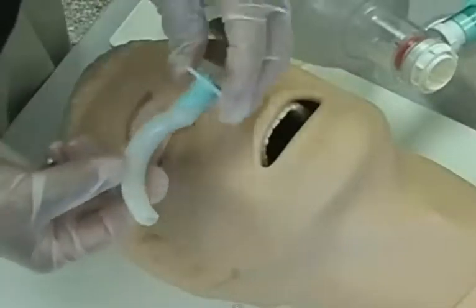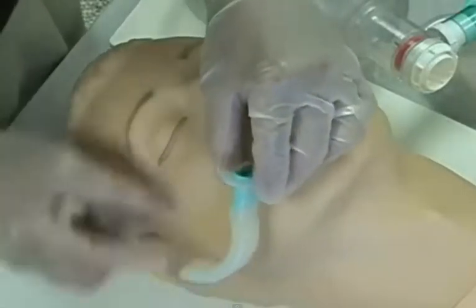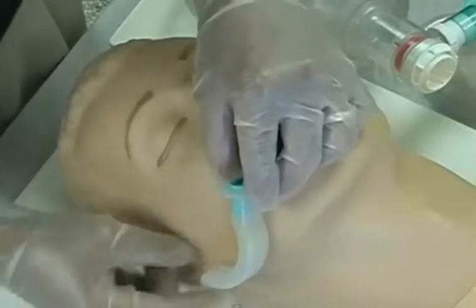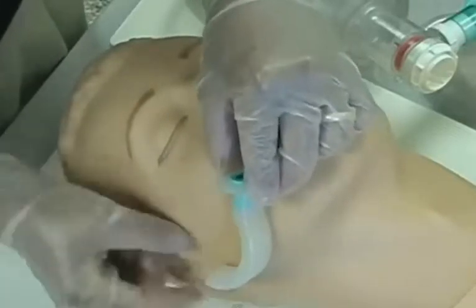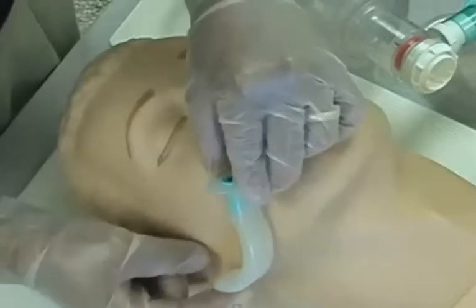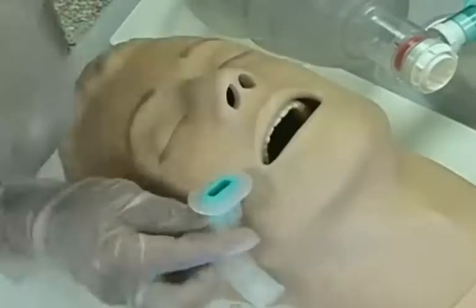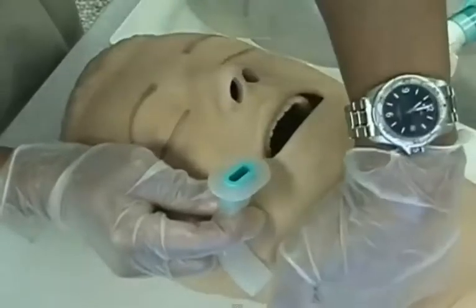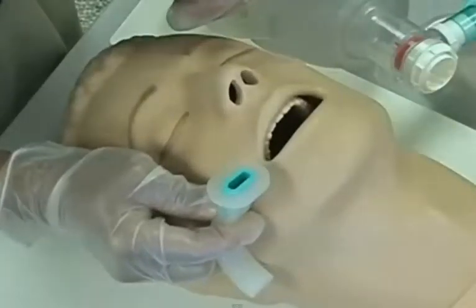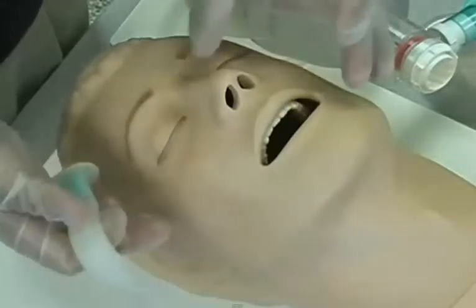There are several ways of correctly sizing an oropharyngeal airway. Some textbooks will recommend going from the corner of the mouth in the inverted position to the tip of the earlobe, in which case this airway would be just about the right size, maybe slightly small. Other texts will recommend looking from a profile view and making sure that it goes from the mouth to the angle of the jaw.